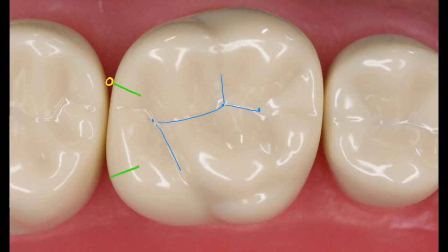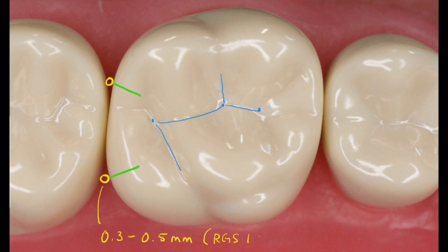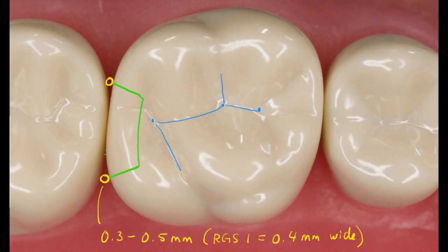Starting with the distal, we're going to have exit angles that make 90-degree exits with the unprepared tooth structure that will achieve a clearance of 0.3 to 0.5 millimeters, which is essentially the same as an RGS1 width of 0.4 millimeters. That's a great tool to use to measure your performance in this particular aspect of the preparation. The axial wall will follow the outer curvature of the preparation as it's dropped down gingivally and this is going to be slightly convex.